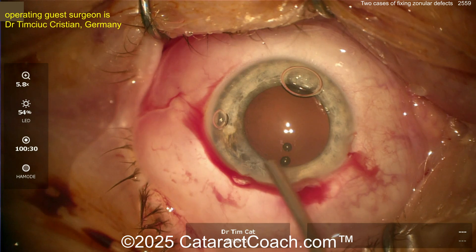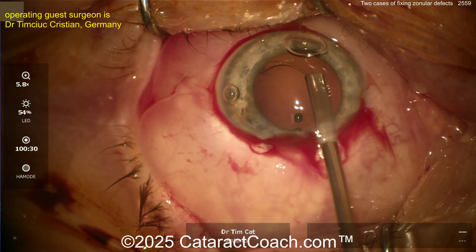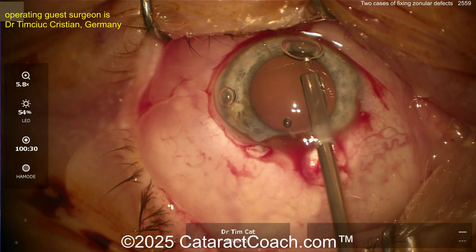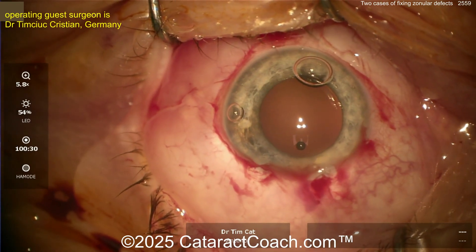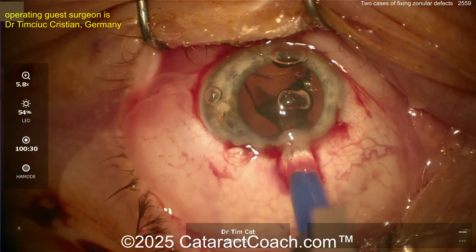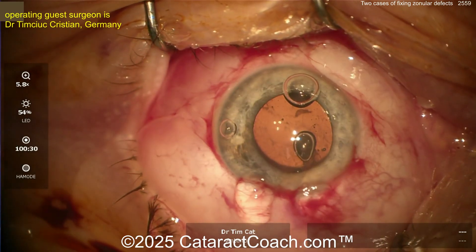You can do a stepwise approach: place a CTR, put the IOL in, and see if it's stable enough. Here comes the CTR — getting it going around nice and easy. I do it a little differently with a Sinskey hook to guide the leading eyelet, but whatever system you like is fine. There it is — it's in the bag. Now you put the lens in and see if it's stable enough.